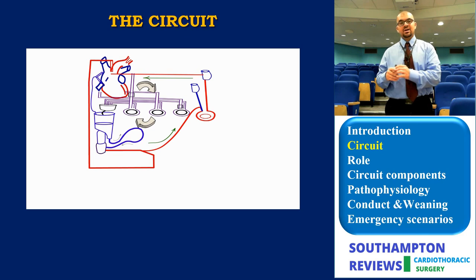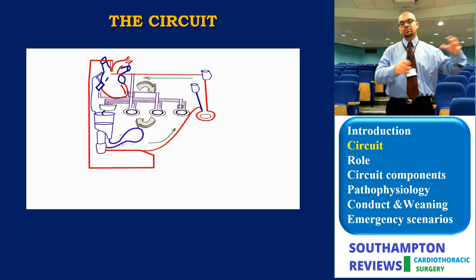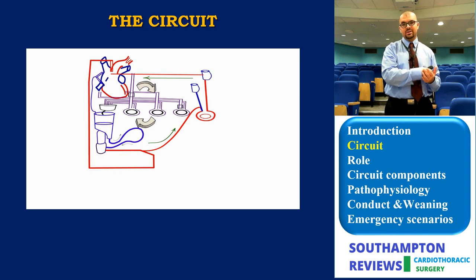However, the suckers are meant to drive blood from the surgical field to the reservoir in a function of protecting the patient from blood loss and also achieving good visualization. But both of them essentially draw blood from the surgical field back to the pump.